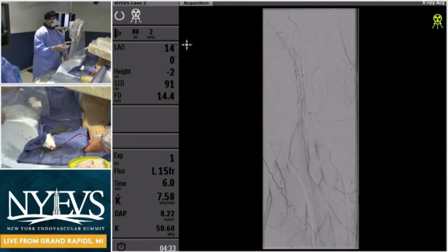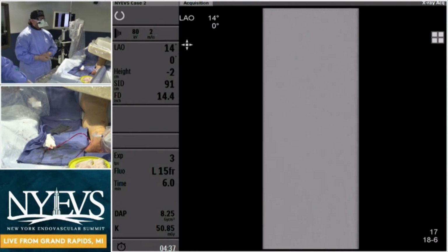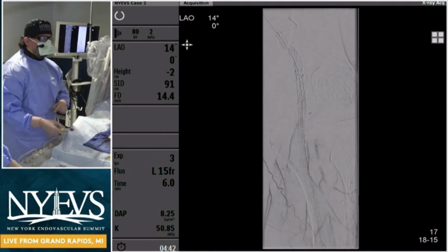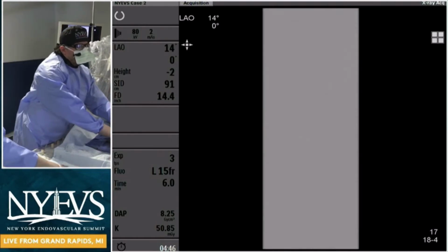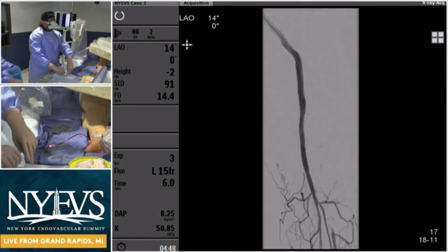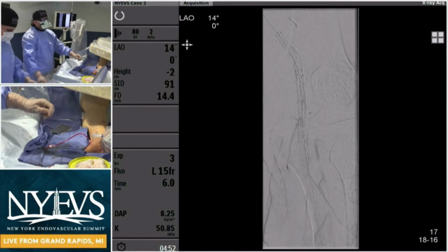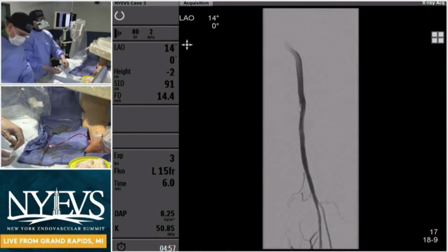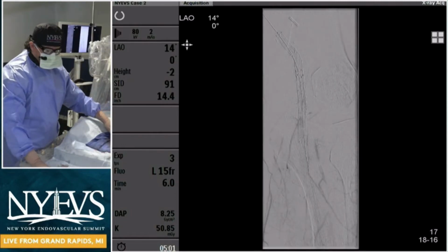So this is an angiogram from the sheath. Yep. Beautiful. And beautiful again, result. It's really encouraging for the AT that I think if we go back retrograde, we can get that if we need to in the future. So this is not a true single vessel runoff. I just want to point that out to the audience and to the panel, right? You always get that question: would you do it if it's the last vessel? Clearly here, this is not a single vessel runoff, as you can see, which is a good thing.